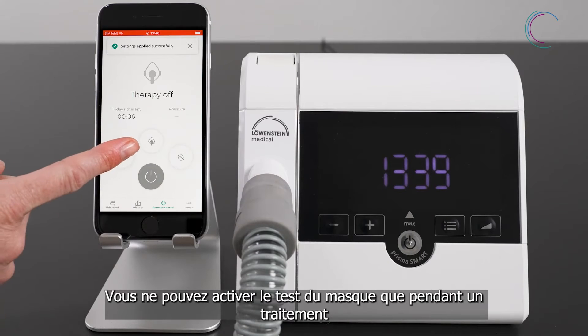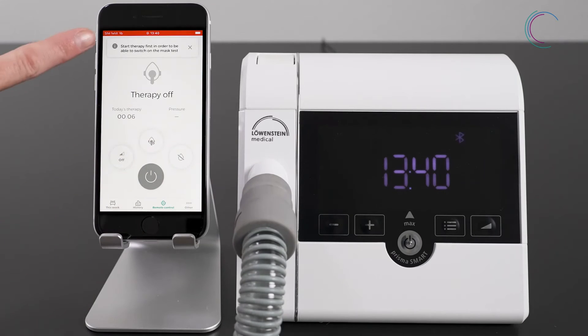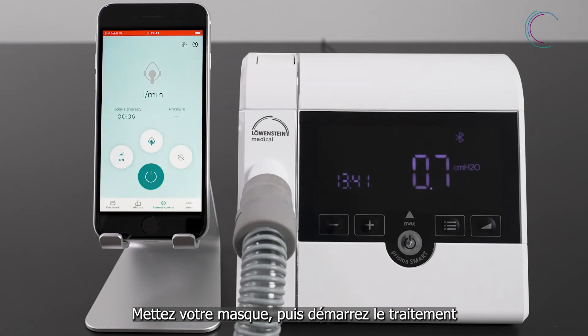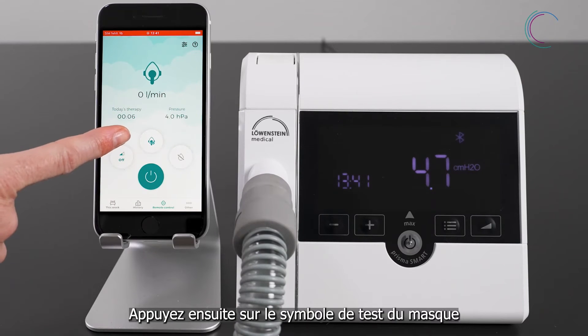Now you will see the mask test symbol in the remote control. You can start the mask test only if the therapy is running. So put on your mask and then start the therapy. After that, you can press the mask test symbol.